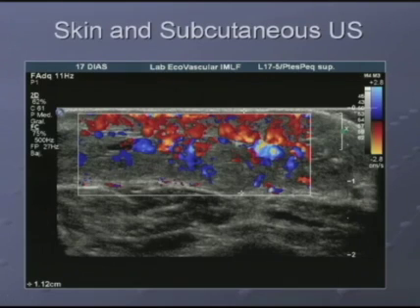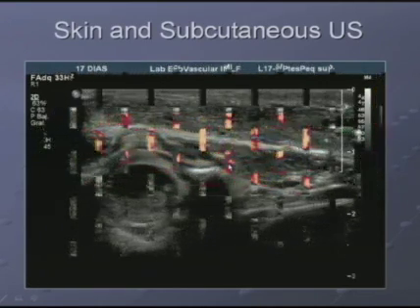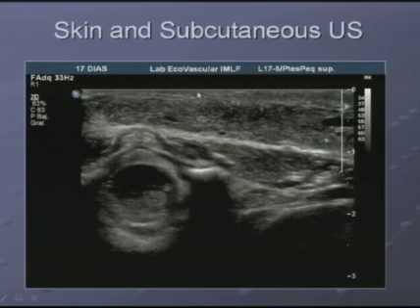This case corresponds to a hemangioma, a very, very vascularized and superficial lesion. Here with power Doppler. And here it was a 17-day newborn. And here we have the lesion in B mode. This is the spine here, and this is the superficial planes.